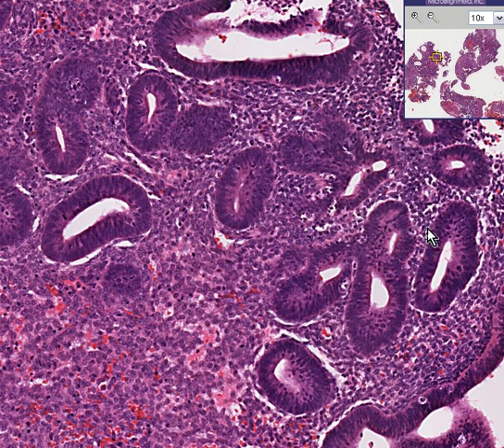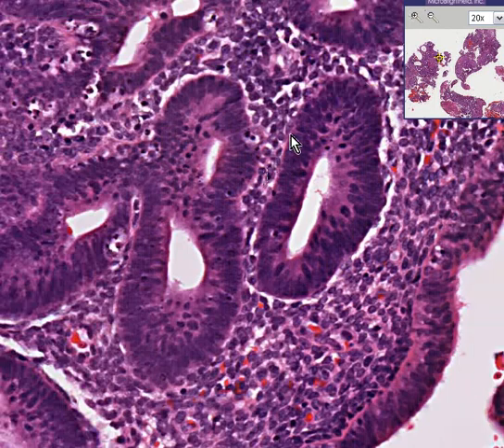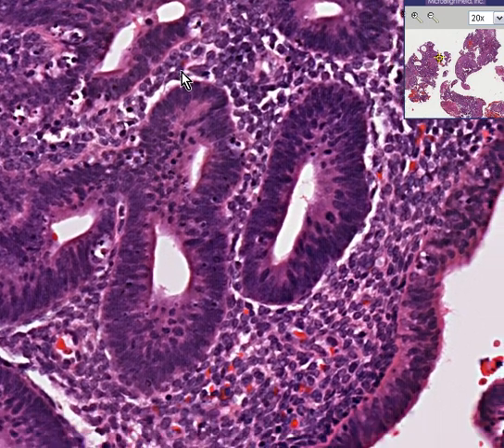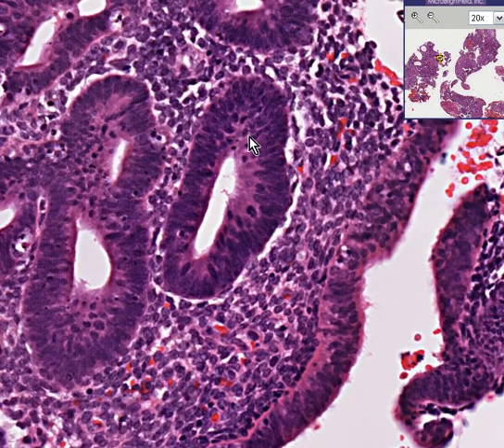They are not back to back. In, for example, a malignant process, you could very well see these glands coming directly back to back with this gland, in which there is no intervening stroma. And here you have a nice amount of stroma. Also notice that within the glands themselves, of course, you can see increased mitotic activity, but that in itself would not be a criteria for malignancy. This is hyperplasia of the endometrium. Thank you very much.